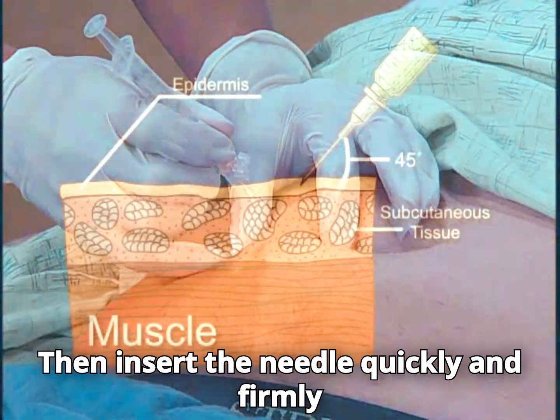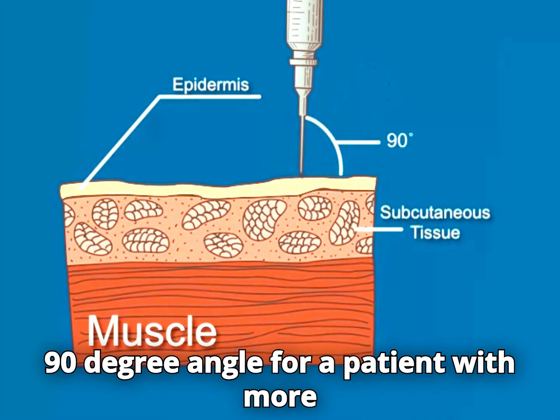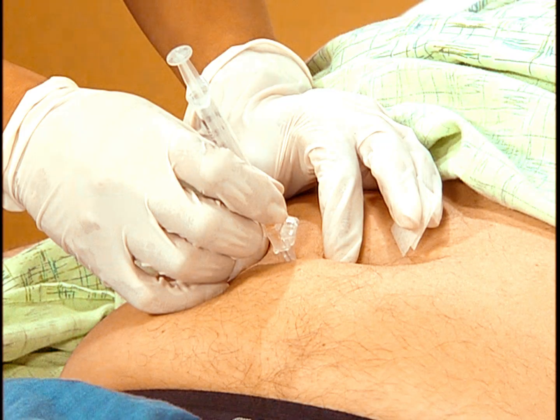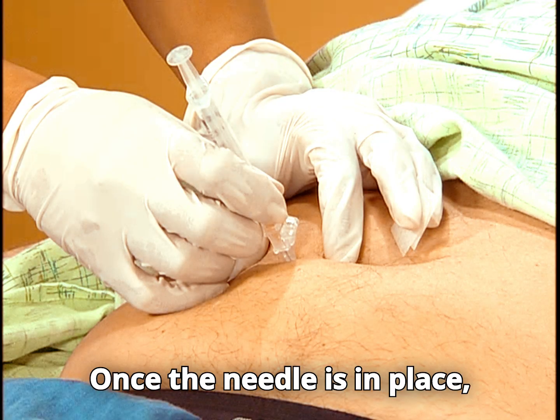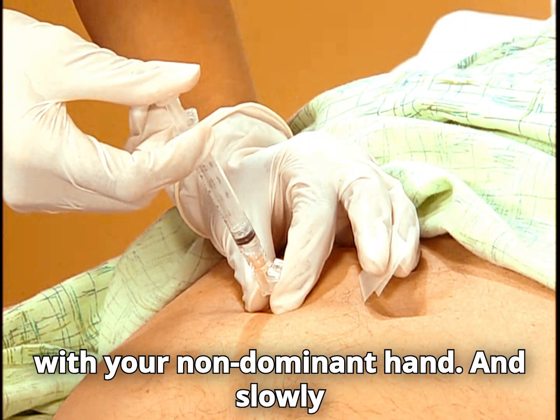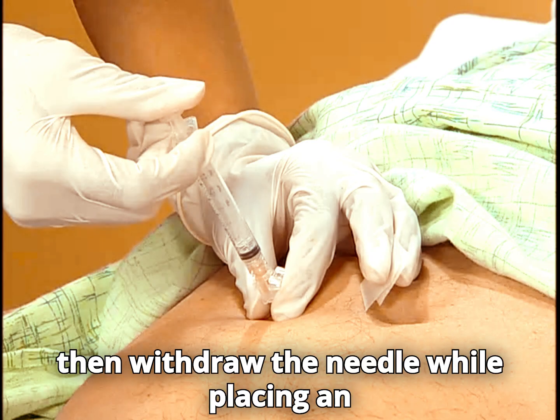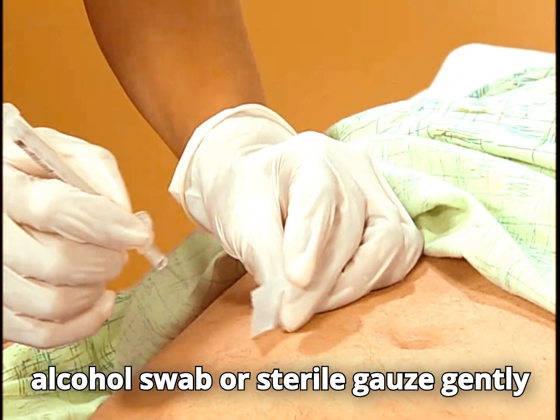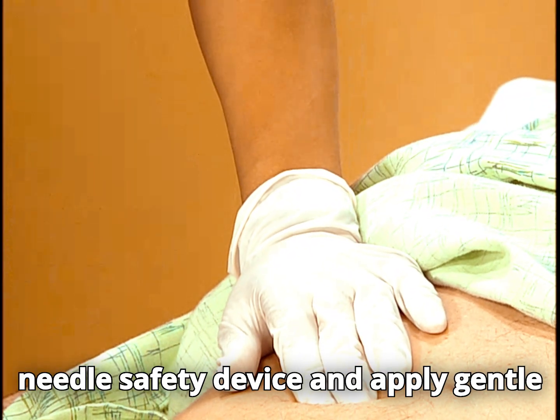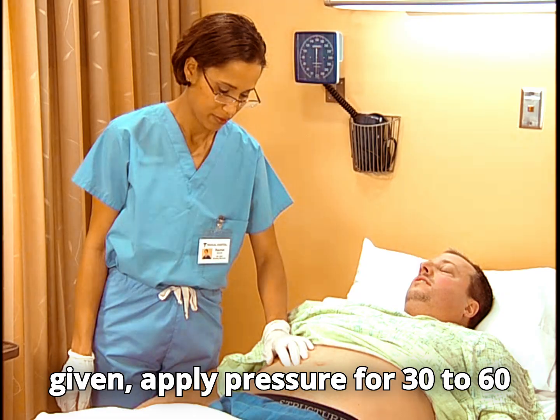Then insert the needle quickly and firmly at a 45 to 90 degree angle for an average size patient, or at a 90 degree angle for a patient with more subcutaneous tissue. If the skin was pinched up, release it. Once the needle is in place, stabilize the lower end of the syringe with your non-dominant hand and slowly inject the medication with your dominant hand. Avoid moving the syringe. Then withdraw the needle while placing an alcohol swab or sterile gauze gently over the site. Engage the needle safety device and apply gentle pressure to the site, but do not massage it. If heparin was given, apply pressure for 30 to 60 seconds.